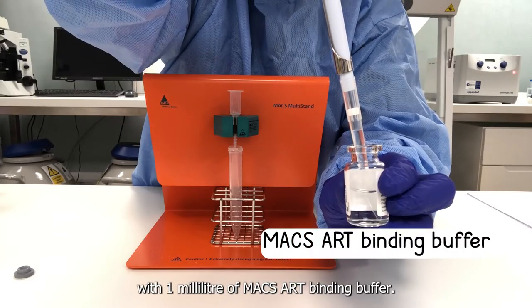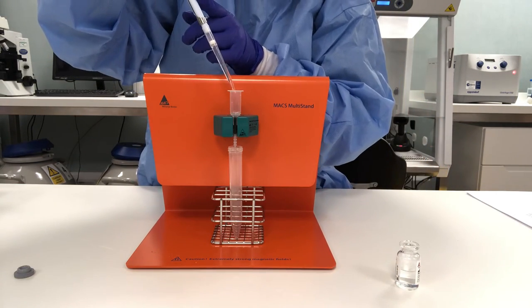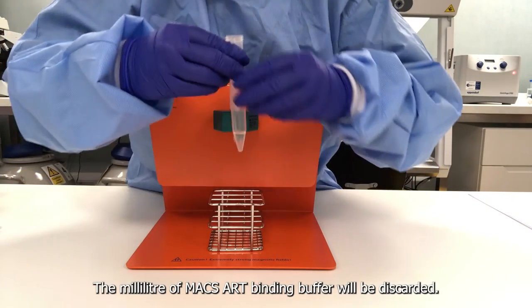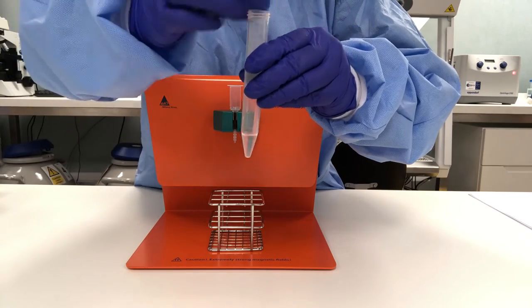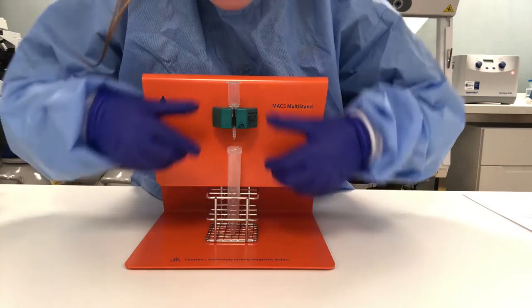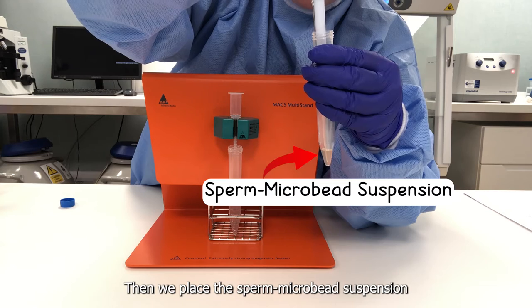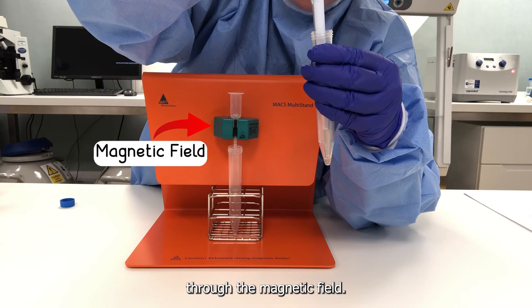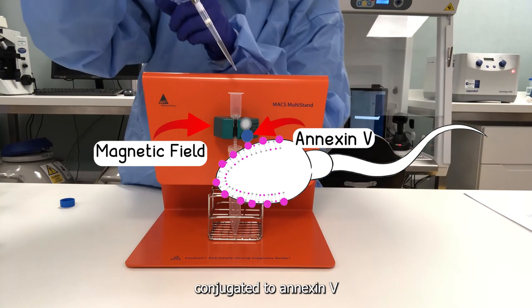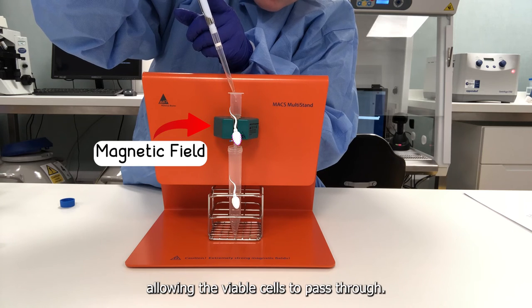Then we rinse the column with 1 ml of MACS-ART binding buffer, and that 1 ml will be discarded. We place a new tube, then we place the sperm microbead suspension through the magnetic field. The apoptotic sperm cells attached to the magnetic microbeads conjugated to Annexin-5 will be trapped in the column by the magnetic field, allowing the viable cells to pass through.